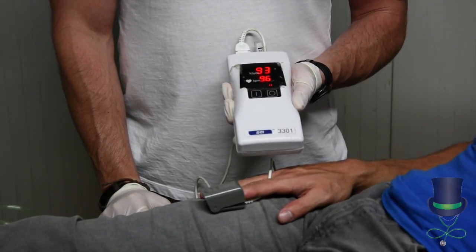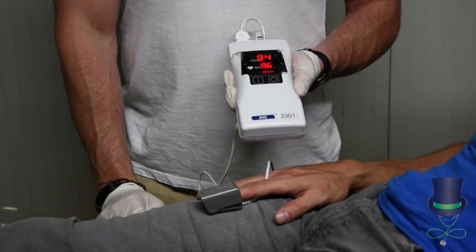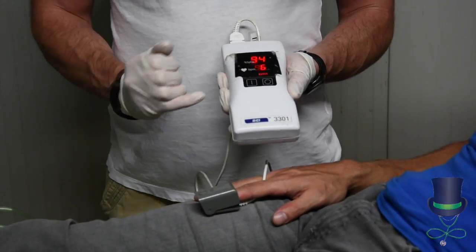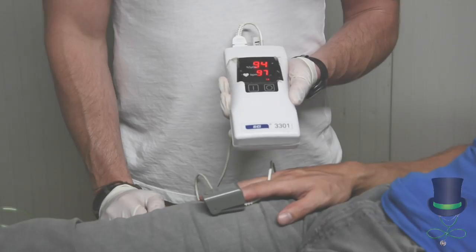The pulse oximeter will give the SpO2 reading, or the oxygen saturation levels of the patient, and will also give the beats per minute of the pulse.